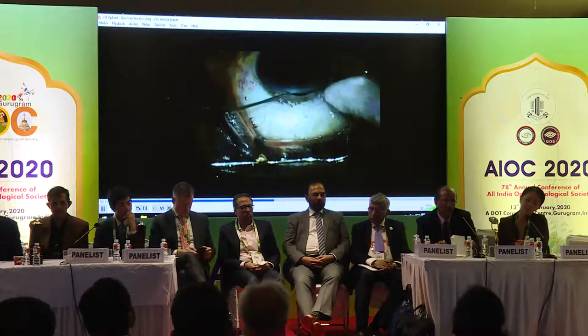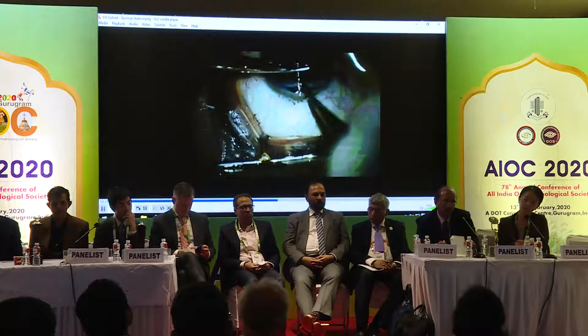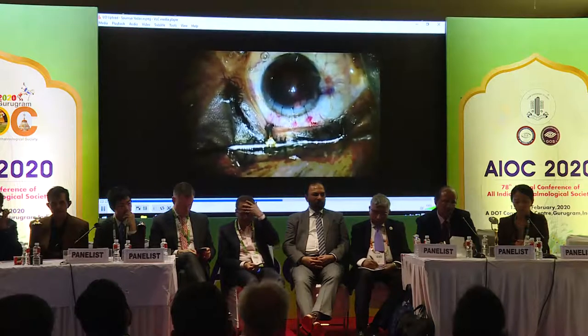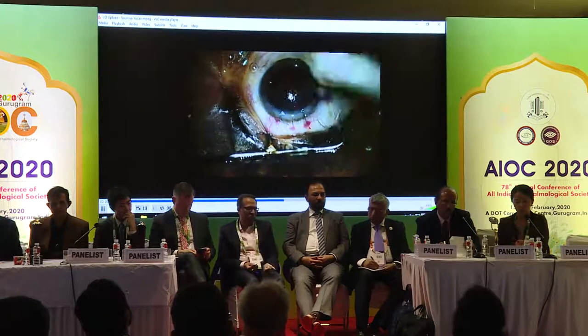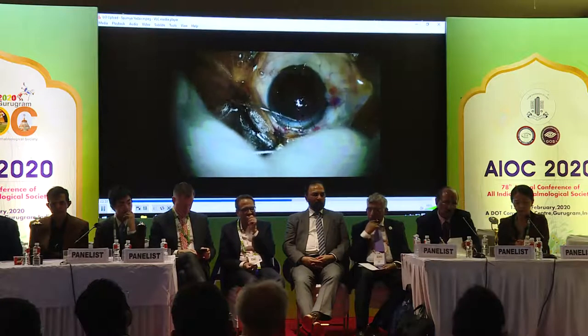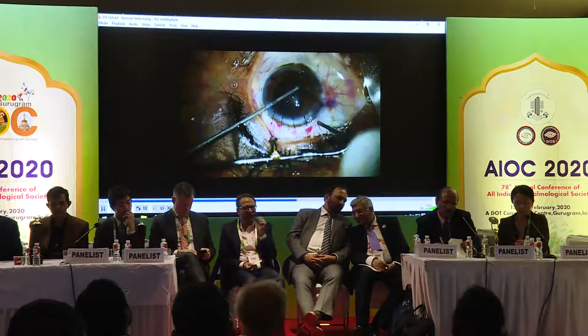After carefully removing any vitreous from the wound, the wound was sutured. Intracameral pilocarpine was injected and a limited anterior vitrectomy was performed.